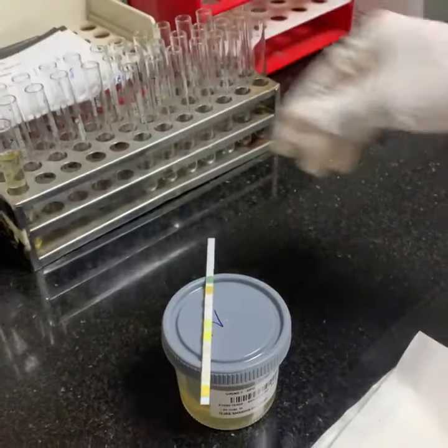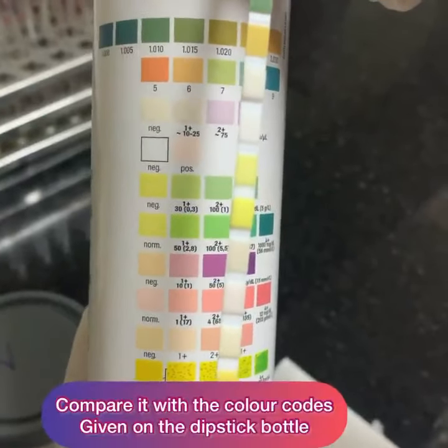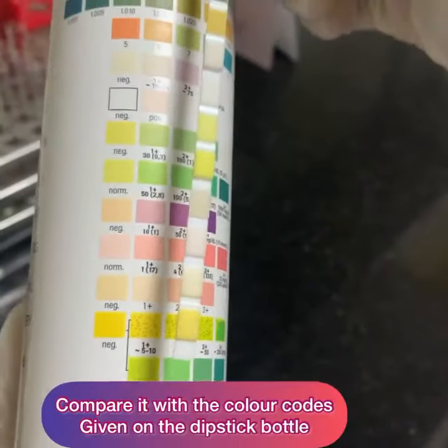Now compare it with the color codes that are given on the dipstick bottle.